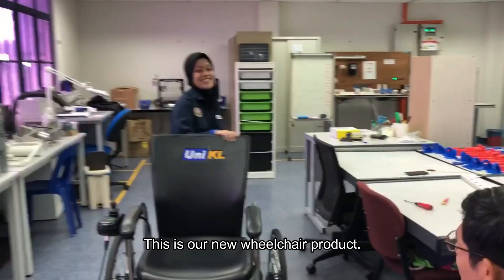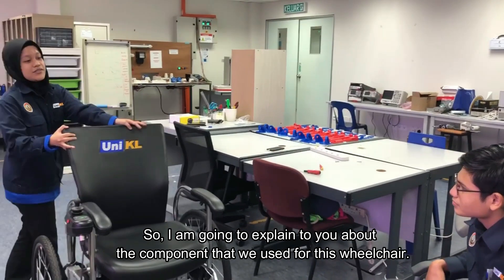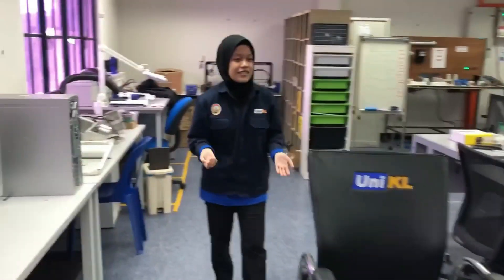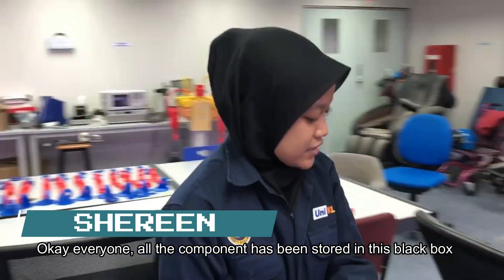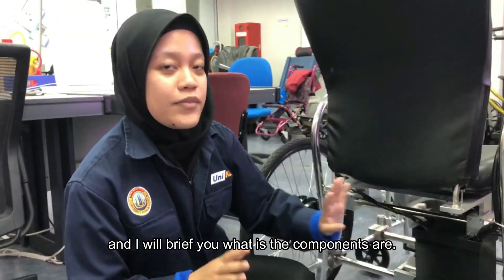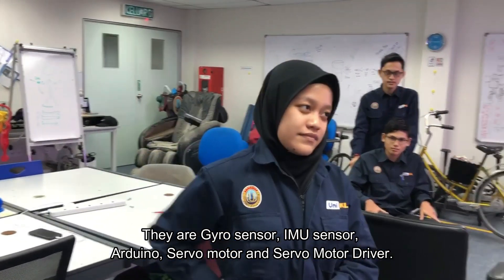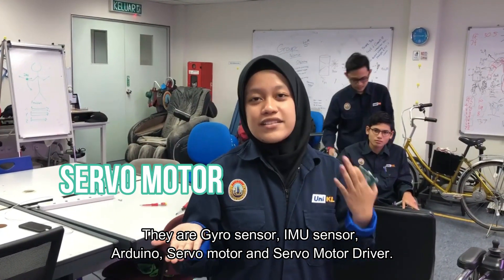Hello sir. Hello. This is our new wheelchair product. I'm going to explain the components we use for this wheelchair. All the components have been stored in this black box. I will review what the components are: gyro sensor, IMU sensor, Arduino, servo motor, and servo motor driver.